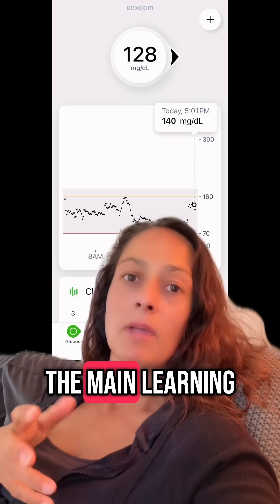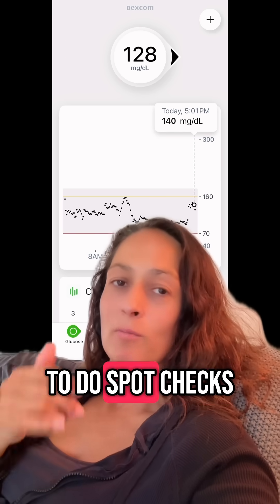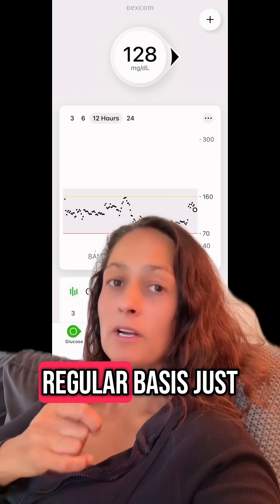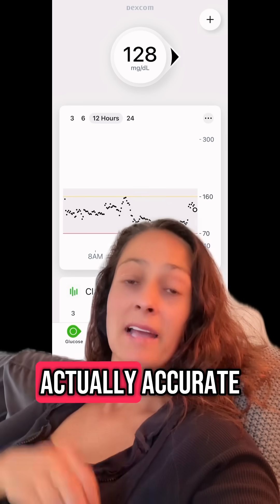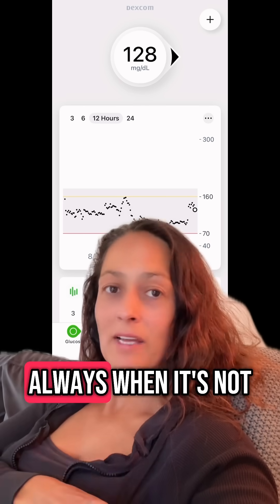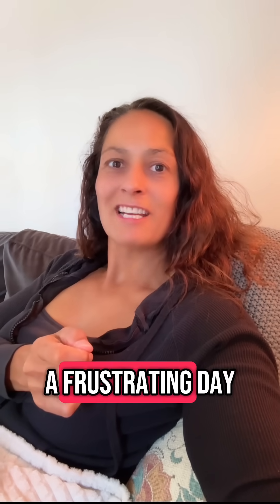I think the main learning here is I have to remember to do spot checks or finger sticks on a regular basis, just to check that my Dexcom CGM is actually accurate, because it's not always. When it's not, the good thing about the Dexcom CGM is that I can calibrate it, and that's what I'm doing. But yeah, a frustrating day.